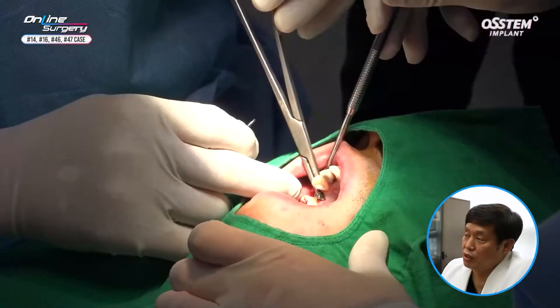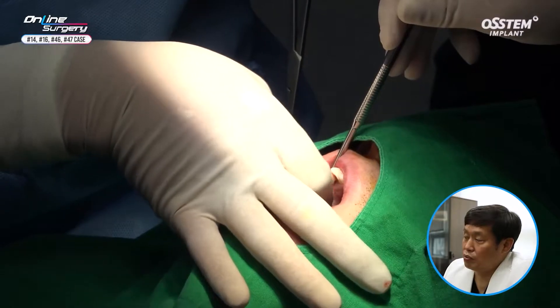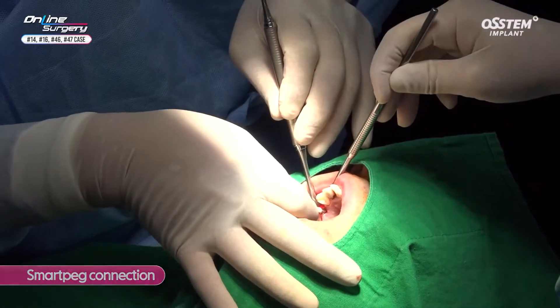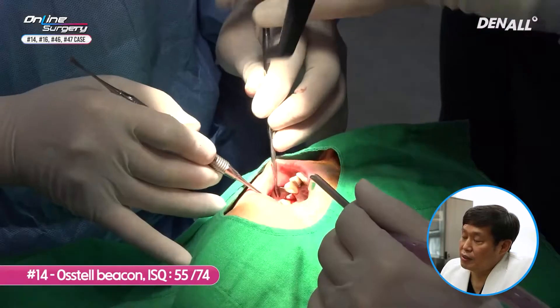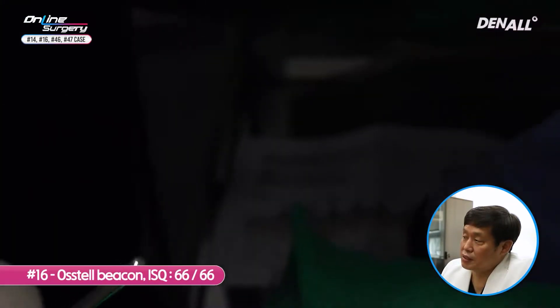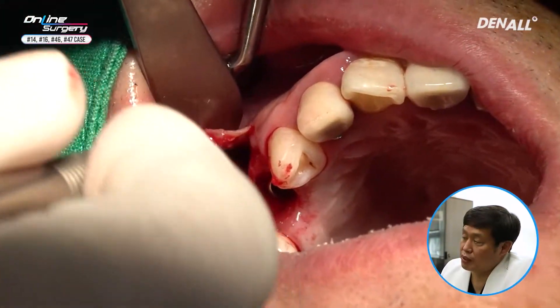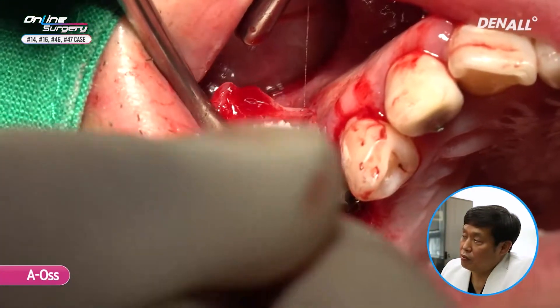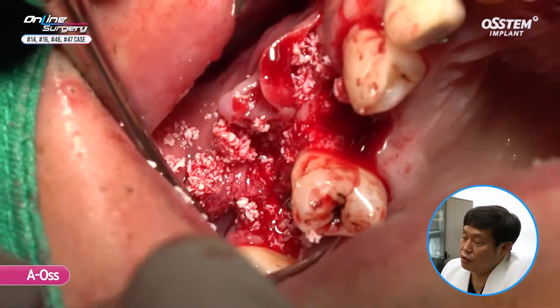I decided to change to a 4.5 diameter, but only a 4.5 by 10mm implant was available, so I placed it freehand, more palatally. Primary stability is about 10 Newton centimeters. Pre-mount is used and then removed. ISQ value on one side is 55 and 74; on the distal side it is about 66 and 66. GBR will be performed after reflecting the flap, and the fenestration defect on the buccal side is checked.